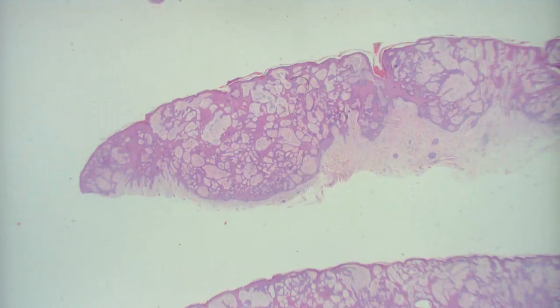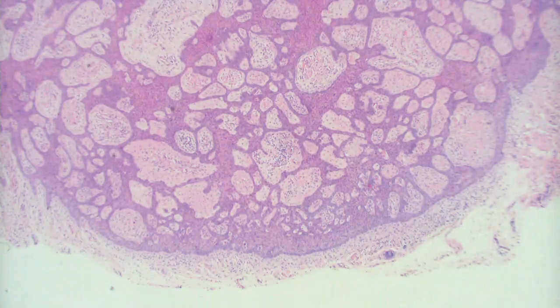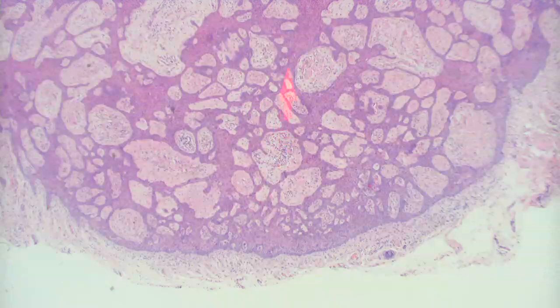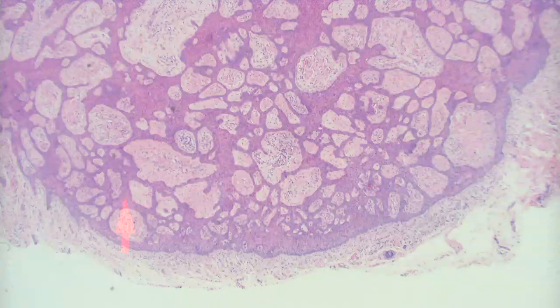It is follicular. Good. So lots of little cysts and some fronding, and some of it looks like it's trying to recreate some follicles there. What area of the follicle do you think these are recapitulating? The tiny hair shaft and the follicular infundibulum. Yeah, it's probably just beneath the infundibulum in the so-called mantle zone. That's kind of a little stem cell area.